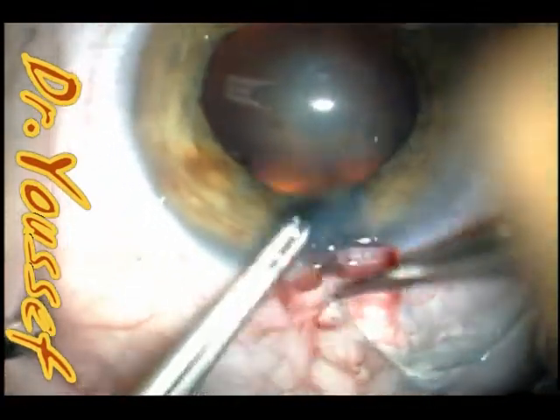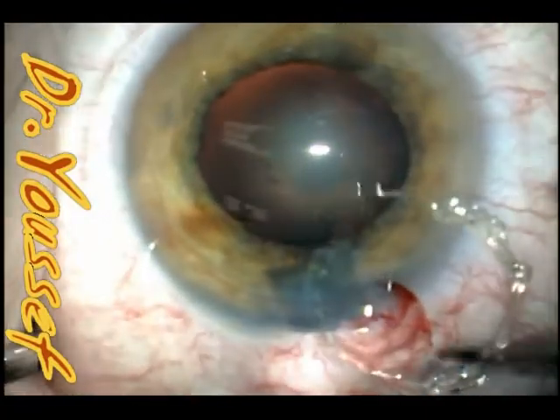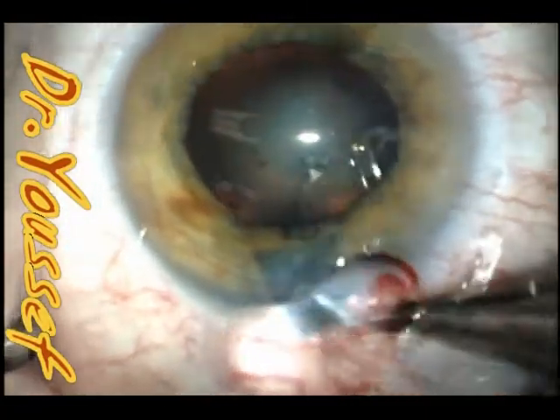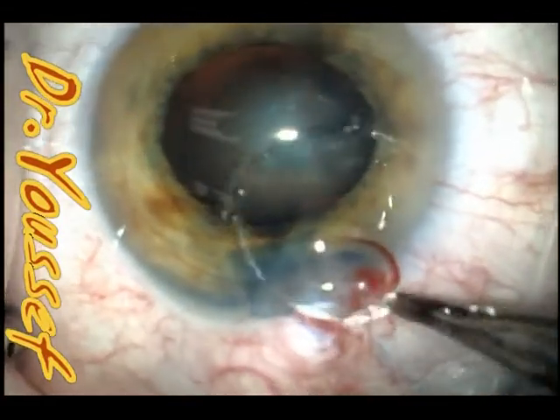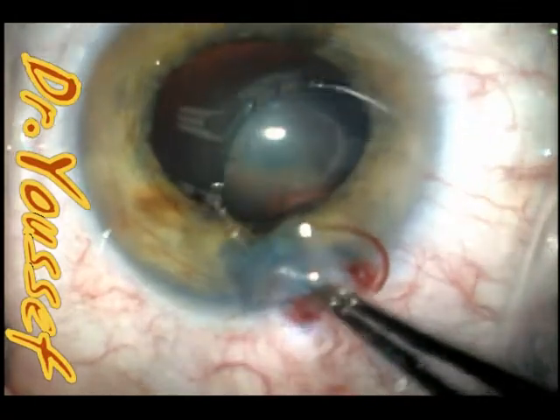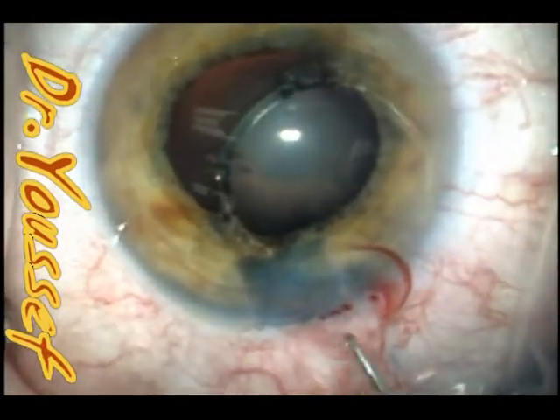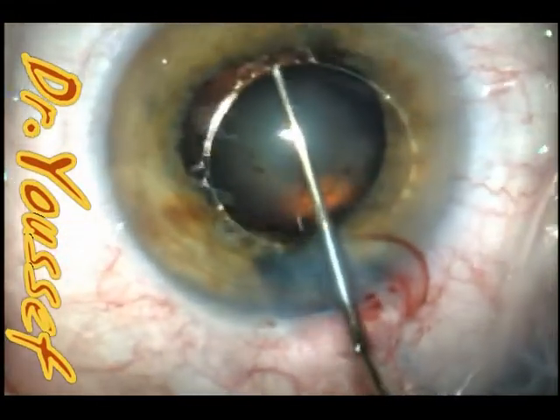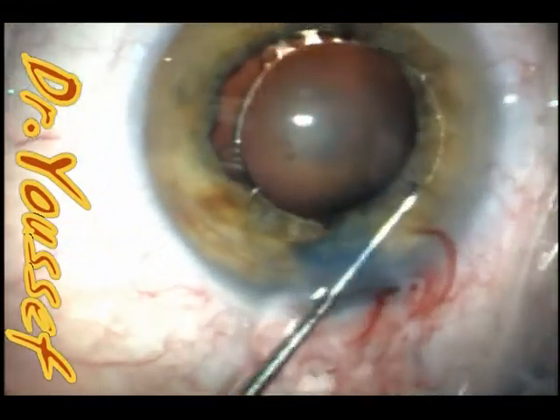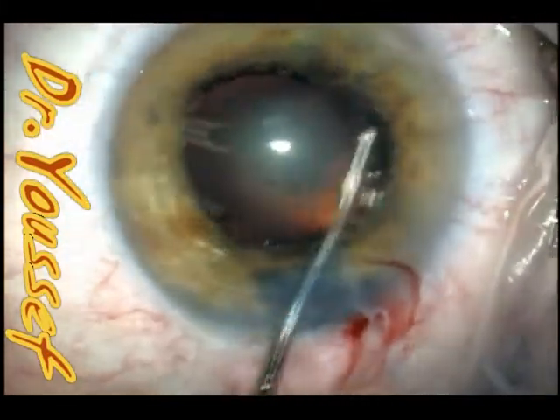What I'm putting now is the Malyugin pupil expansion ring, which helps a lot in these cases. It's introduced easily and without needing to put flexible iris retractors, which would need four or five extra wounds. This is much easier to implant and faster, and it produces an equally rounded pupil rather than a squarish or diamond-shaped pupil.